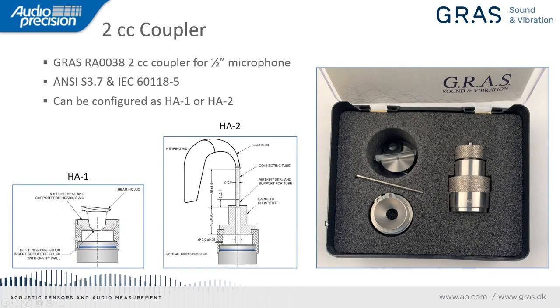Now there's a 2cc coupler required for the production test, hearing aid tests, and this is specified by standards ANSI S3.7 and Part 5 of the IEC 60118-5 series. And Grass makes a nice coupler that meets both of these standards.